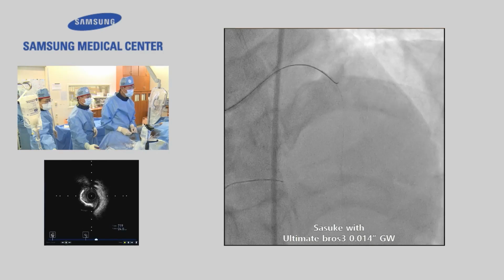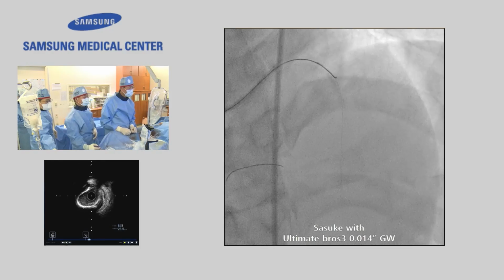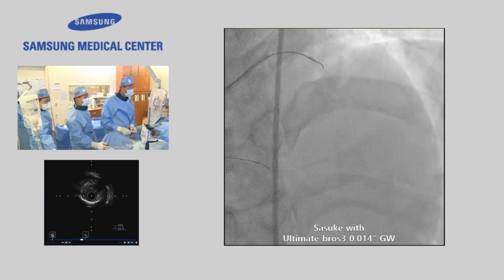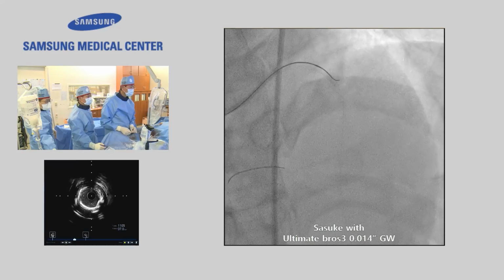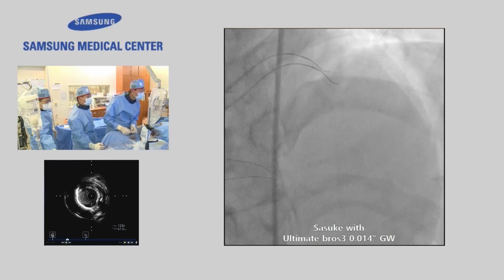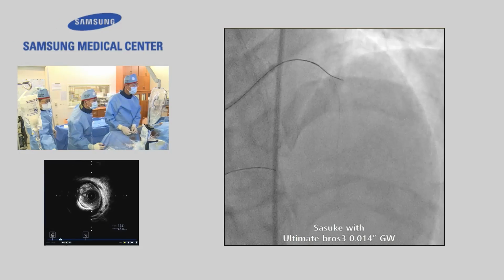Too much curve, maybe. We can find the same position. Yeah, here. Test. Okay. Here I let go down.